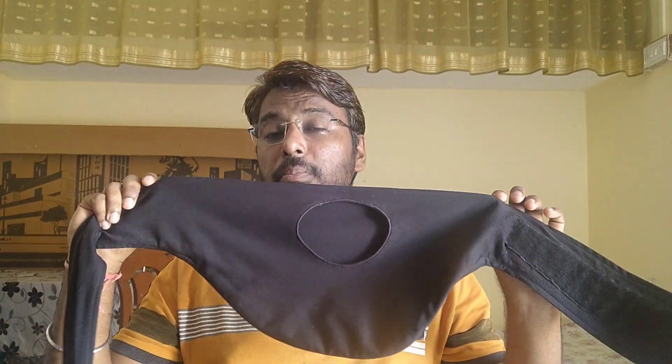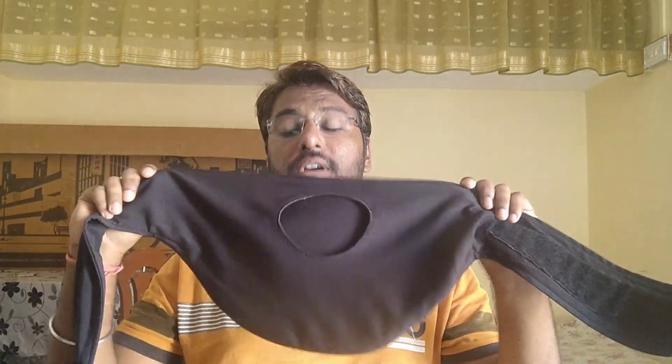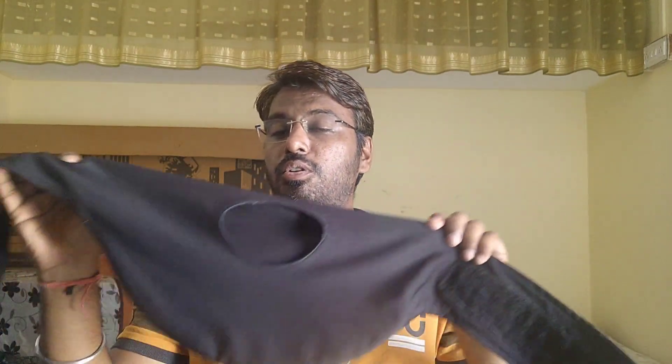First of all, this is a vertical ostomy belt. This is for people who normally put their bag in a vertical position — a straight downward position. This belt can be used for those patients. But in this video I will especially talk about the horizontal belt.